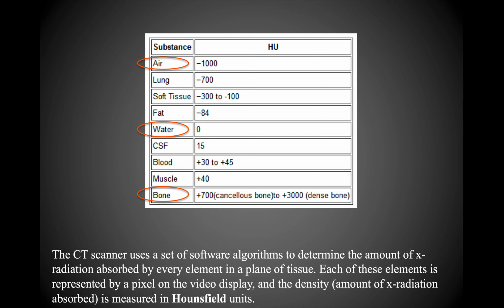And so the way that this is set up is the Hounsfield density of water is 0. And then tissues that are more dense are going to be positive. So you can see with bone being the highest Hounsfield unit because it's the most positive. And then you can see that air is by far the most negative because, obviously, that has the lowest density compared to anything else. And so that has a Hounsfield unit of -1,000. So the scale can be manipulated then to allow for the windowing process that we just talked about.